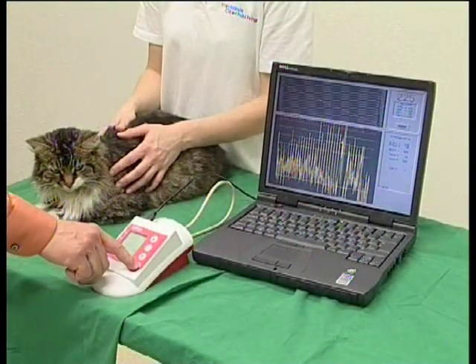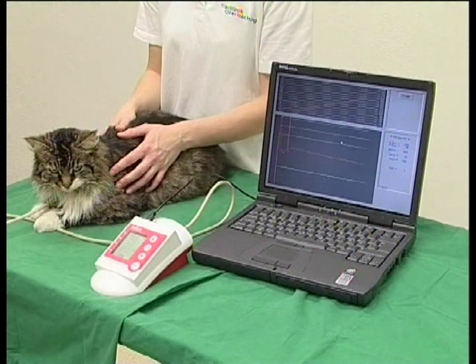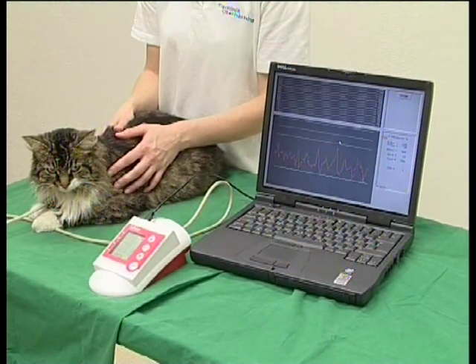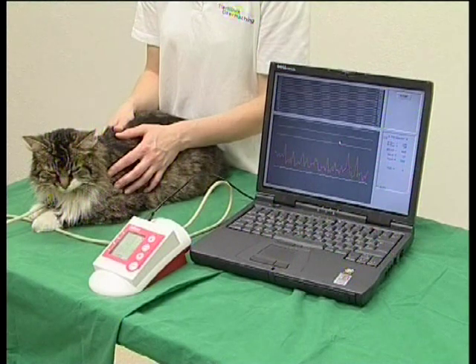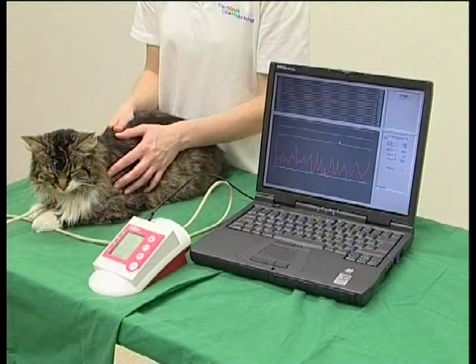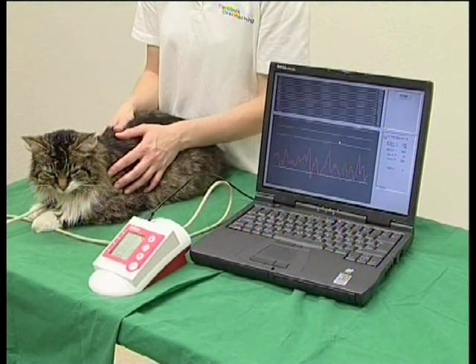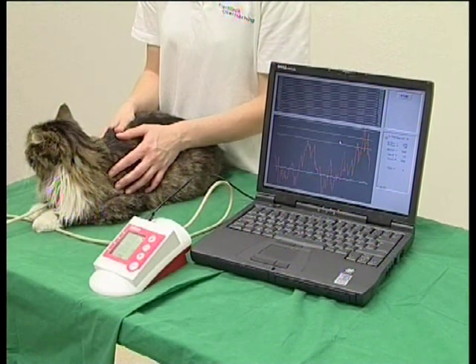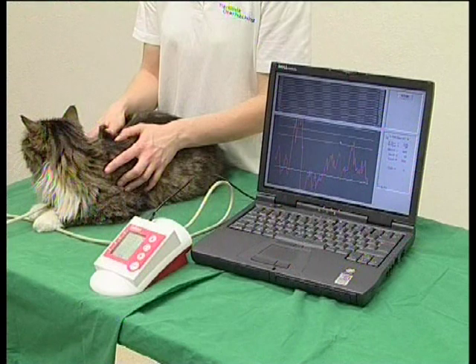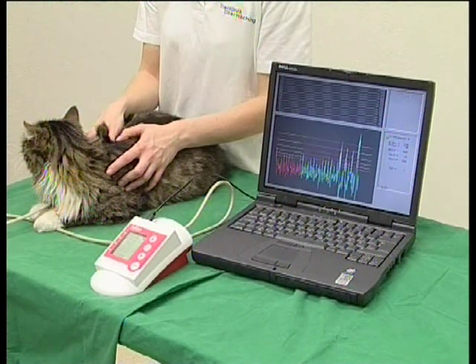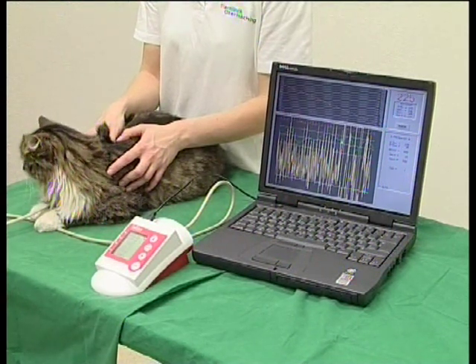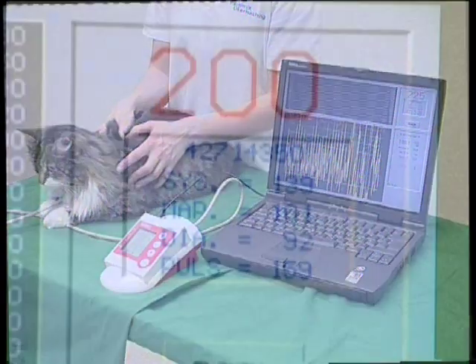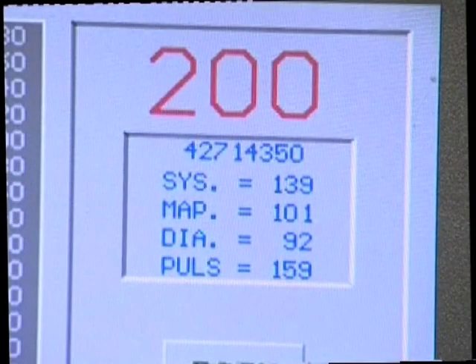This is a typical reading in a cat. At the beginning, the cat is totally relaxed and nice amplitudes are visible. Then it turns its head and the artifacts that are produced can be seen on screen. It shifts weight to the leg which is being measured and contracts muscles, resulting in considerable artifacts. Still, the results given are a valid reading.